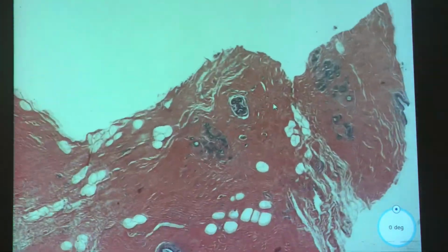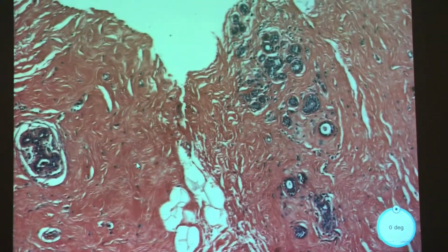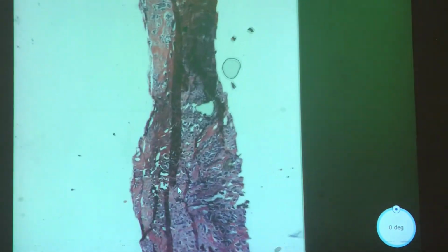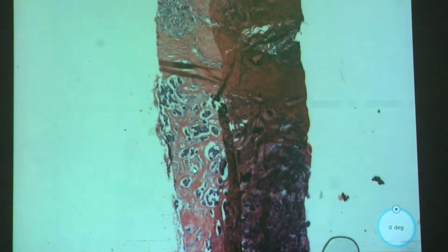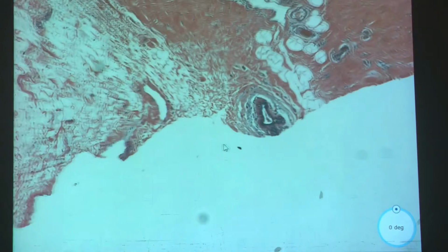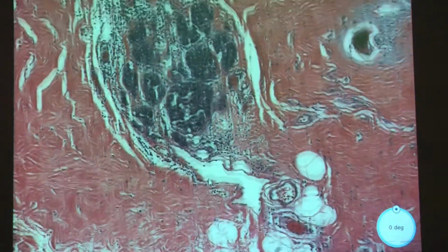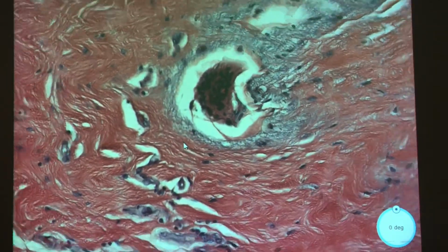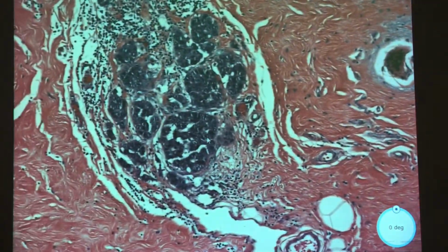The beautiful thing about these is that even though they really like to metastasize, like to lymph nodes and in LVI, they always maintain their architecture. So it doesn't matter where you see micropapillary carcinoma of the breast, it's going to have that same architecture. Whereas a lot of the other tumors kind of change how they look, right? So this one is good that way.